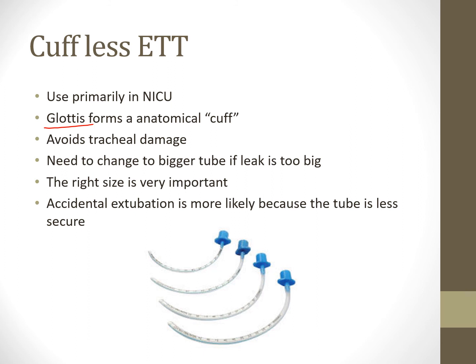Their trachea is bigger. Their glottis, their cricoid cartilage is bigger, right? So when we're looking at that, that's going to be the bigger part of it. Make sure you use the right size for the right size baby, and we're going to talk about that more in perinatology, right? That's where we're getting to it. We'll even go over NRP and all that stuff there.